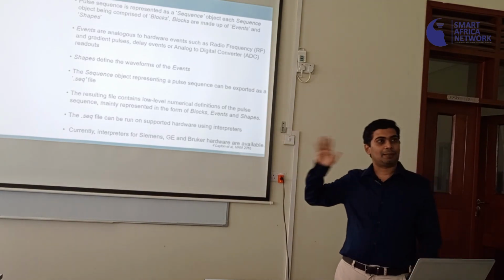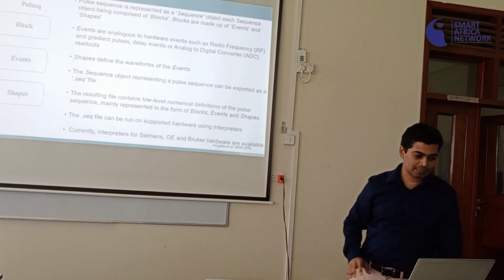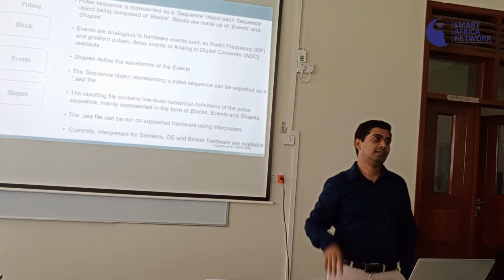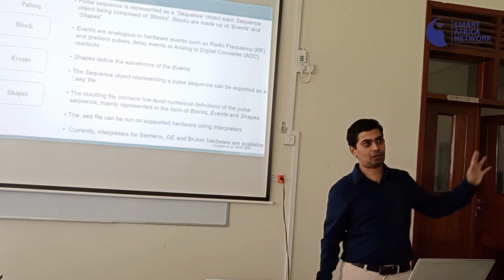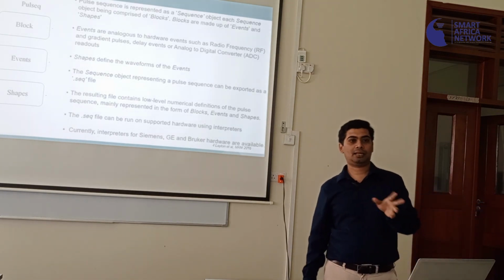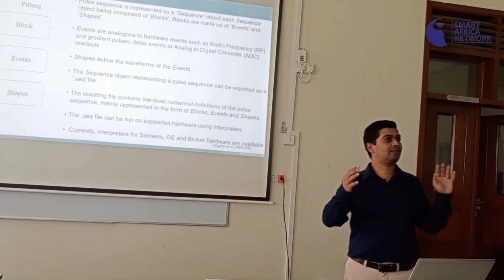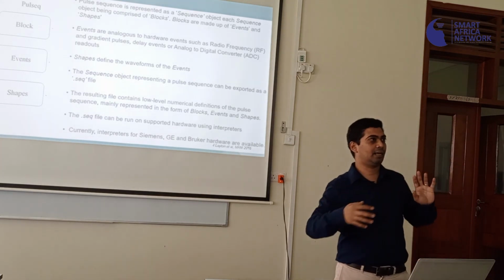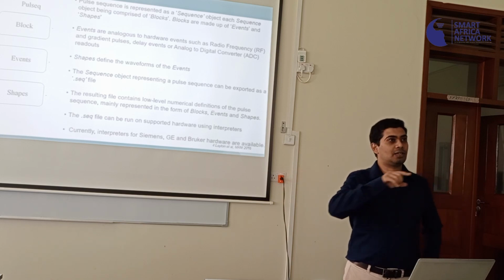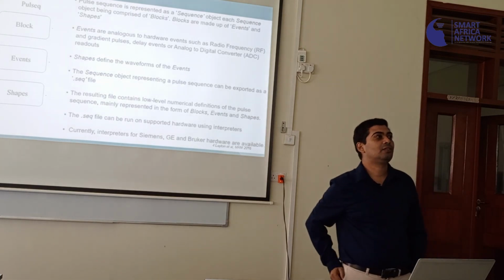Won't bore you with the details, and I'm happy to go into details offline. But the key idea that I want to present is if you're sending pulses to the scanner, saying turn on coil 1, RF coil for example, turn on coil 2, gradient coil for example, and then turn on the receive coil, which is my ADC. How many of you have a background in electrical engineering or the like? Anybody here with electrical engineering? Okay, just one. So I'm just going to quickly talk to you about what happens on an MR system for the rest of you.